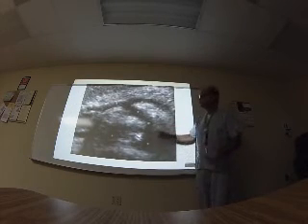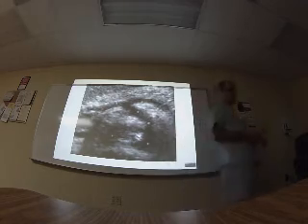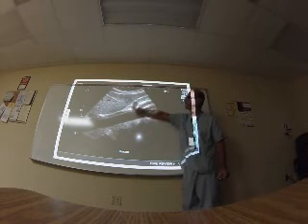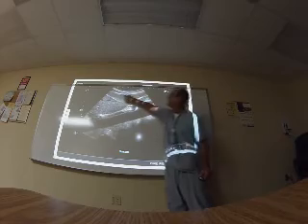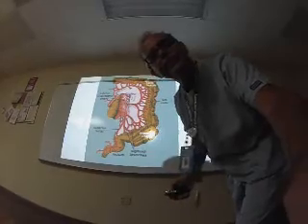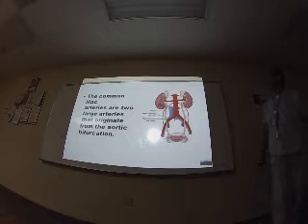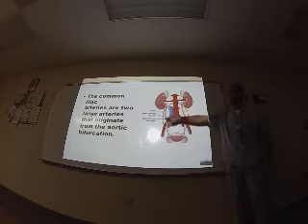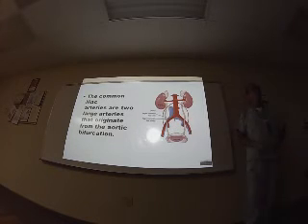You can see here, this is ultrasound: celiac trunk, hepatic artery, and splenic artery. Another picture of the same, what is this? Celiac trunk, this is the superior mesenteric artery, aorta, vertebral column, tip of the liver, peritoneum, that is here. Okay. The common iliac arteries are two large arteries that originate from the aortic bifurcation. We scan the aortic bifurcation for aneurysm because this is the most common area of aneurysm. The aortic bifurcation is right common iliac and left common iliac.